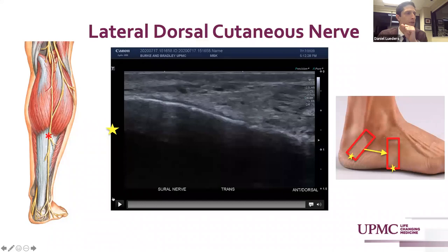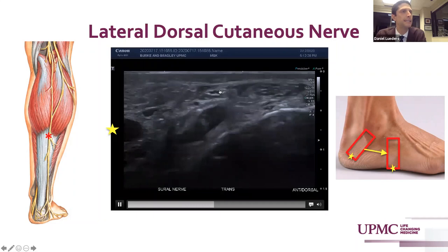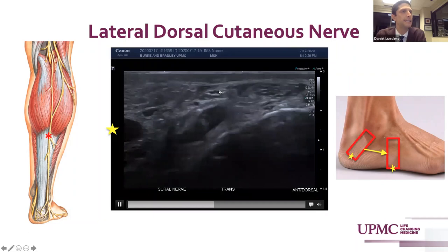At the foot it becomes the lateral dorsal cutaneous nerve of the foot. It courses superficial to your peroneus longus and brevis tendons — we see it going superficial to the longus and then superficial to the brevis. This is a possible site of neuritis, perhaps if there's a peroneal tendinosis or tenosynovitis and inflammation.